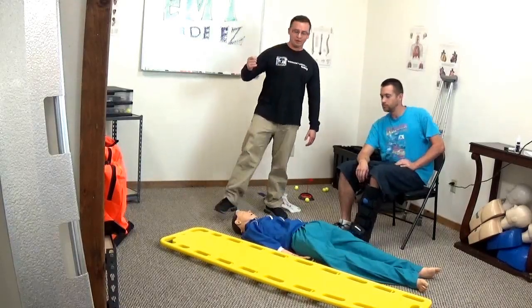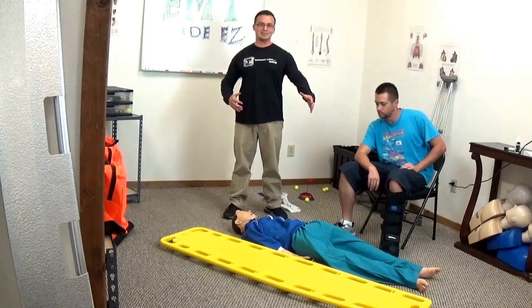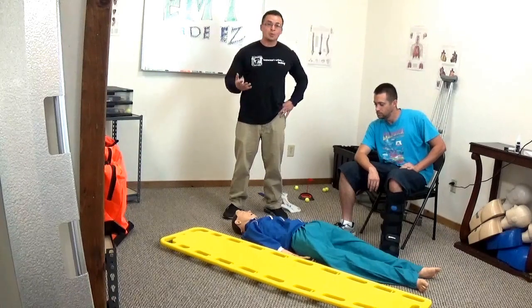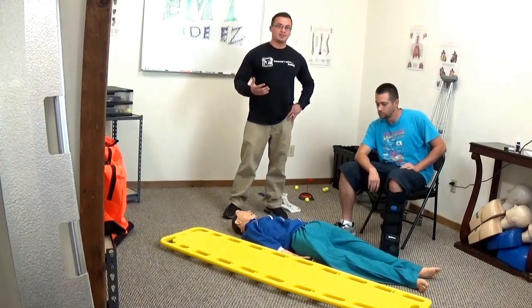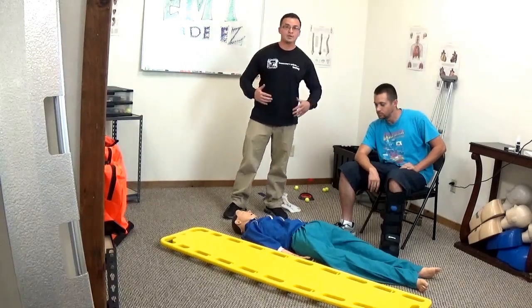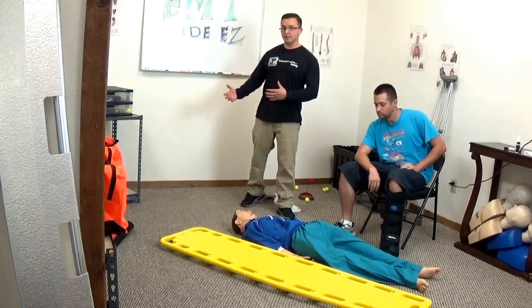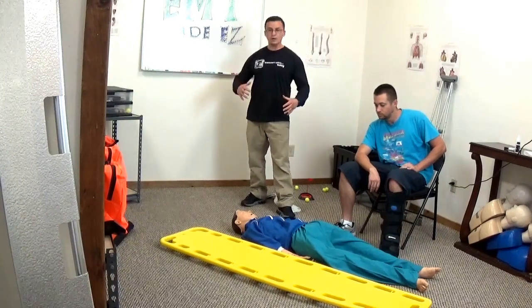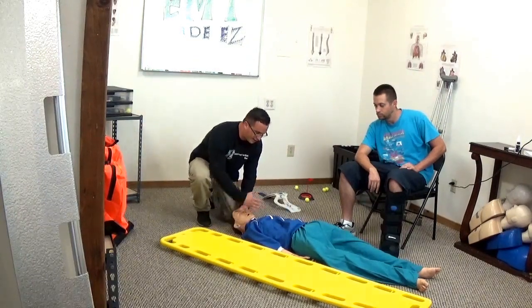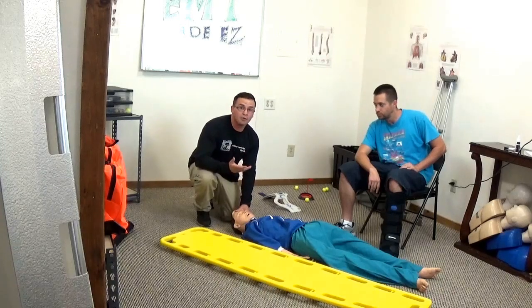In this video we are going over C-spine supine or longboard immobilization of a patient for your NREMT skill. The first thing you want to do is say BSI and tell the proctor that you have everything you need for this skill. Then tell your partner to maintain C-spine — hold the head in line with the body and do not let go until you tell them to.